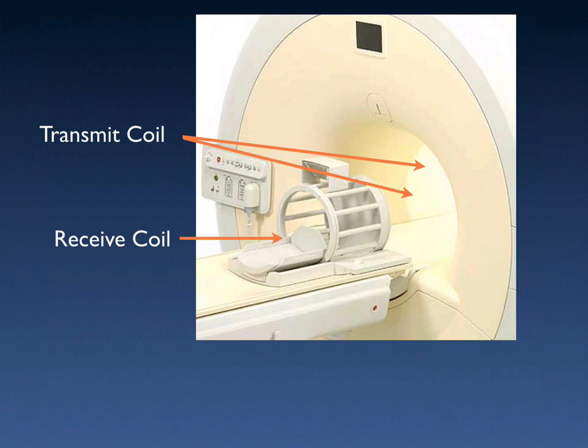It's worth noting that receive-only coils are currently the most commonly used type of coil, local coil, today in modern superconducting cylindrical bore magnets.